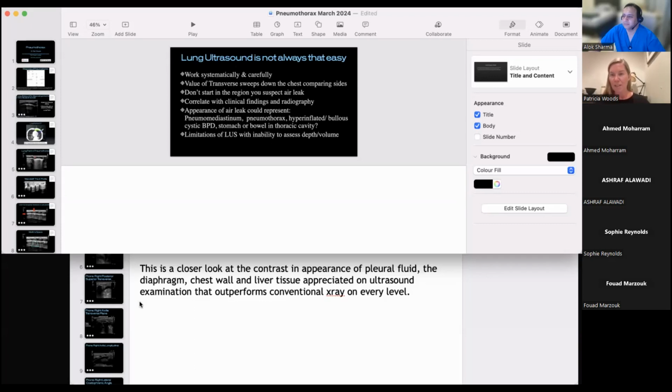But I think it can be a tiny sliver in that sort of pneumomediastinal area, or it could be complete, but actually look pathetic on an X-ray. And of course, you're not going to drain that. So I think understanding that that minute separation can mean anything.